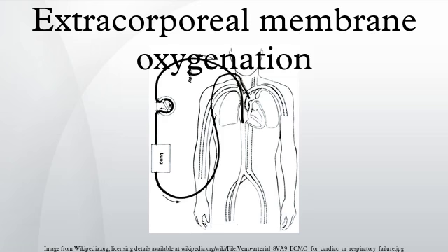In intensive care medicine, extracorporeal membrane oxygenation is an extracorporeal technique of providing both cardiac and respiratory support oxygen to patients whose heart and lungs are so severely diseased or damaged that they can no longer serve their function. Initial cannulation of a patient receiving ECMO is performed by a surgeon or anaesthetist, and maintenance of the patient is the responsibility of the perfusionist or ECMO specialist, who gives 24/7 monitoring care for the duration of the ECMO treatment.